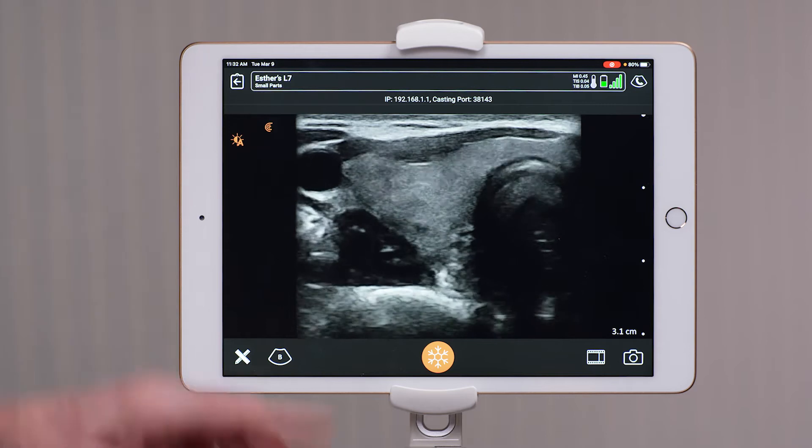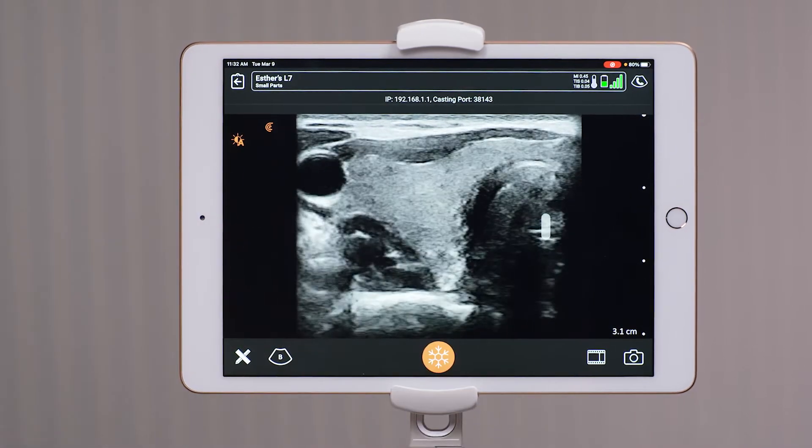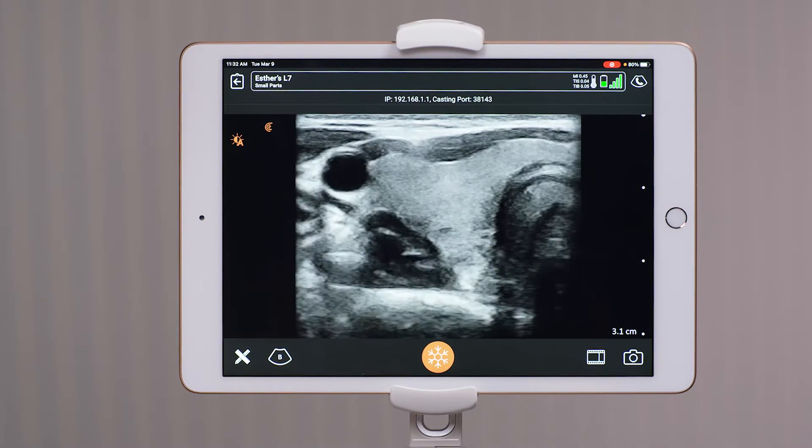To change the gain, you simply take your finger and swipe to the right for increased gain. As you can see now, I'm over gained. I'm actually filling in some of the vessels with artificial echoes.